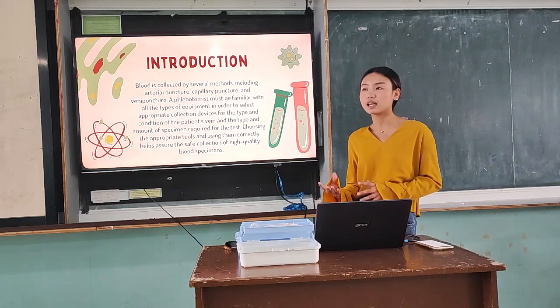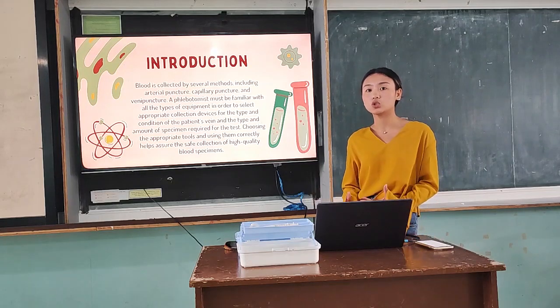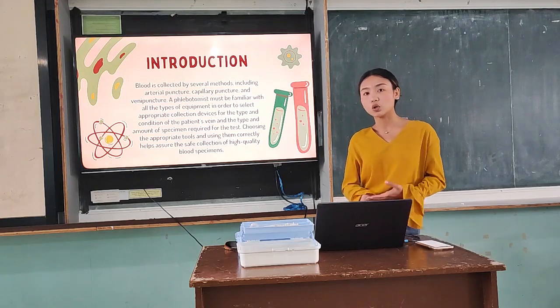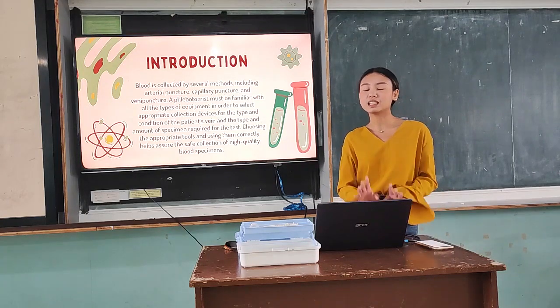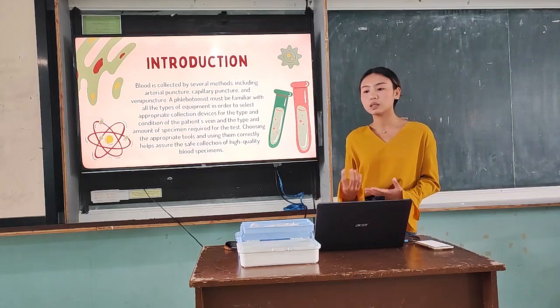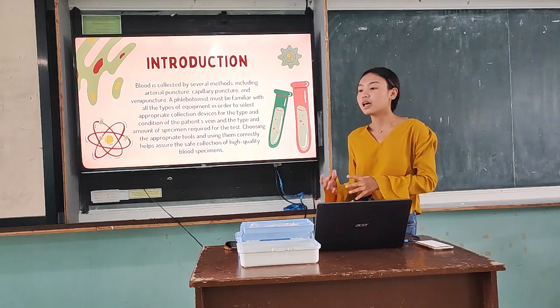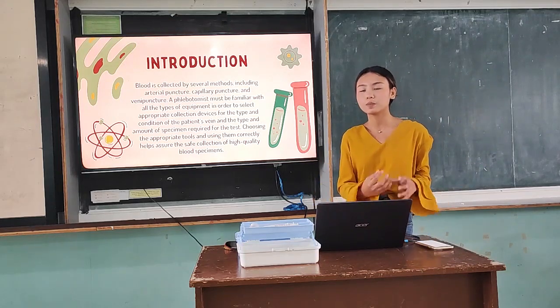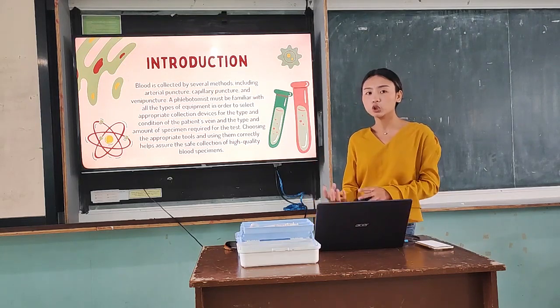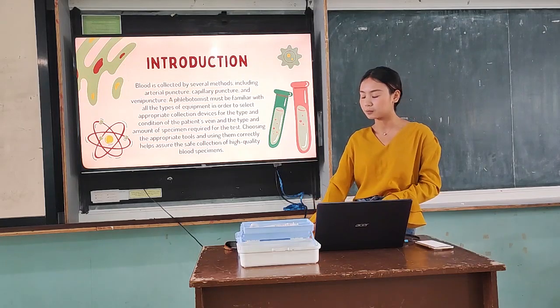So bakit nga ba kailangan matutunan yung iba't ibang uri ng blood collection tubes? Of course, kasi di ba, na-try na ninyo sa practical na mag-collect ng bloods. So, hindi naman siya nagtatapos doon. For example, after collecting the blood, ano nang next? So, what should be the next step for that? And you have to secure that specimen para ma-secure mo na safe yung specimen to make sure na yung result ng test na gagawin mo is accurate and precise.